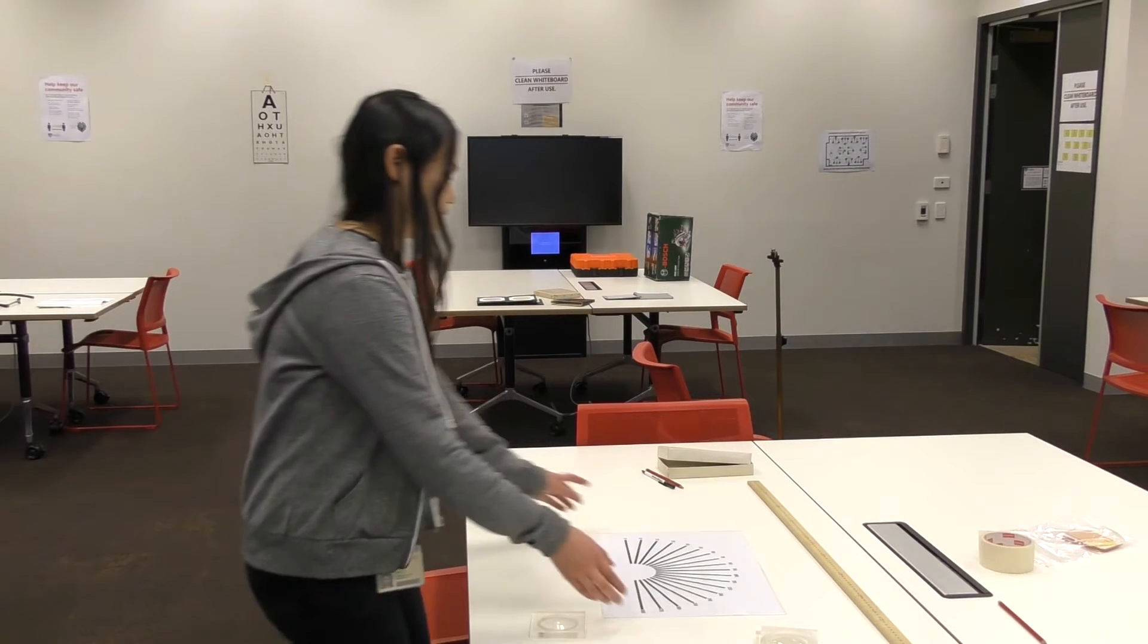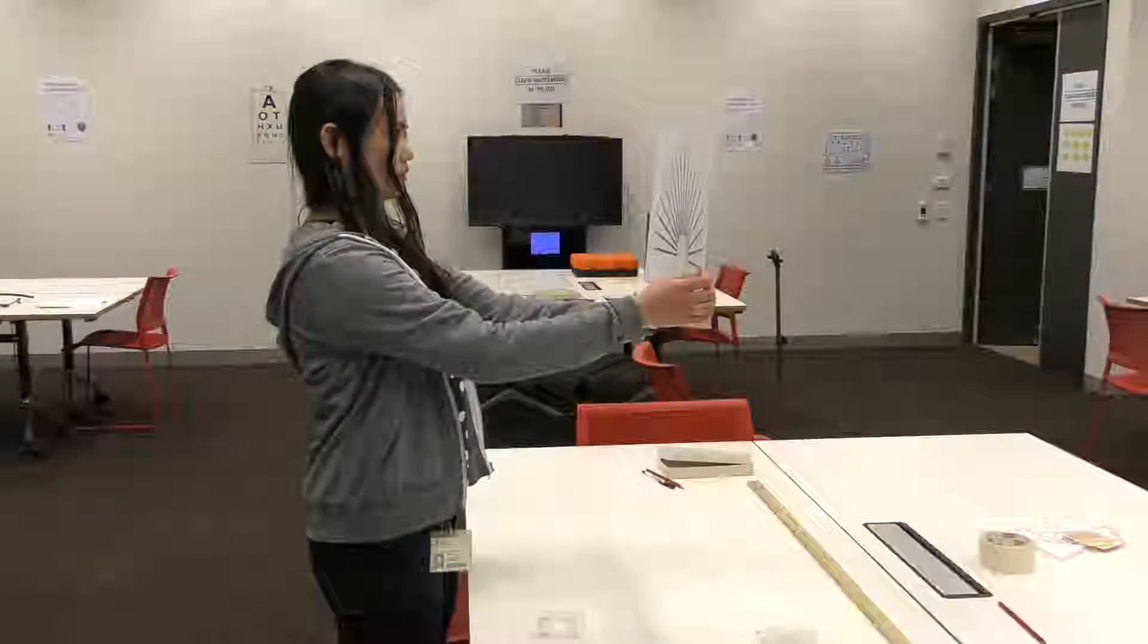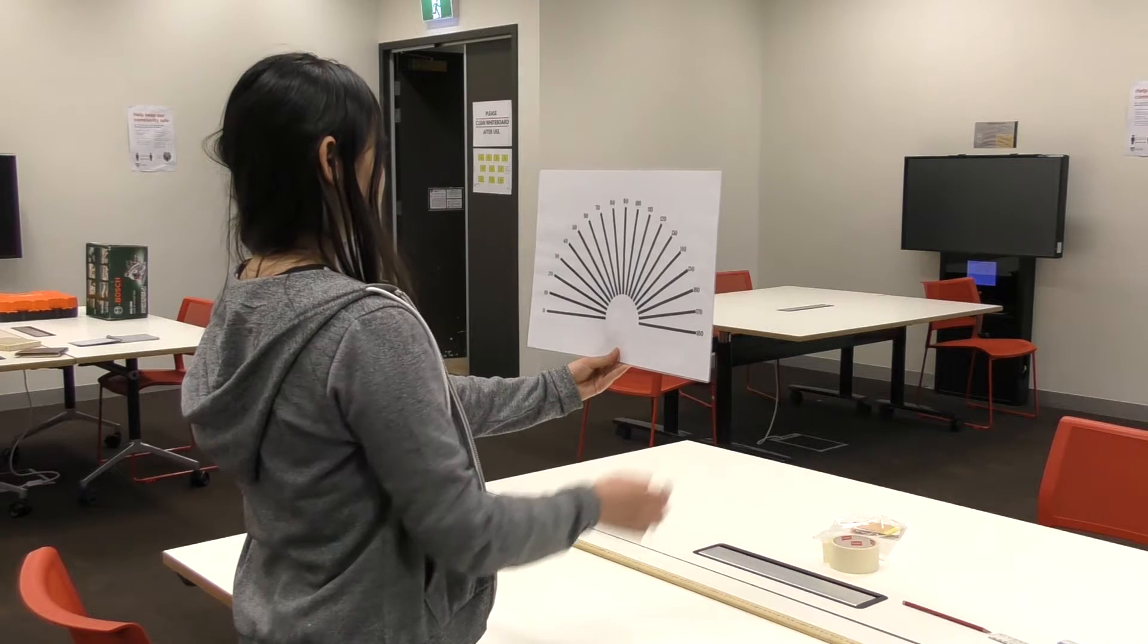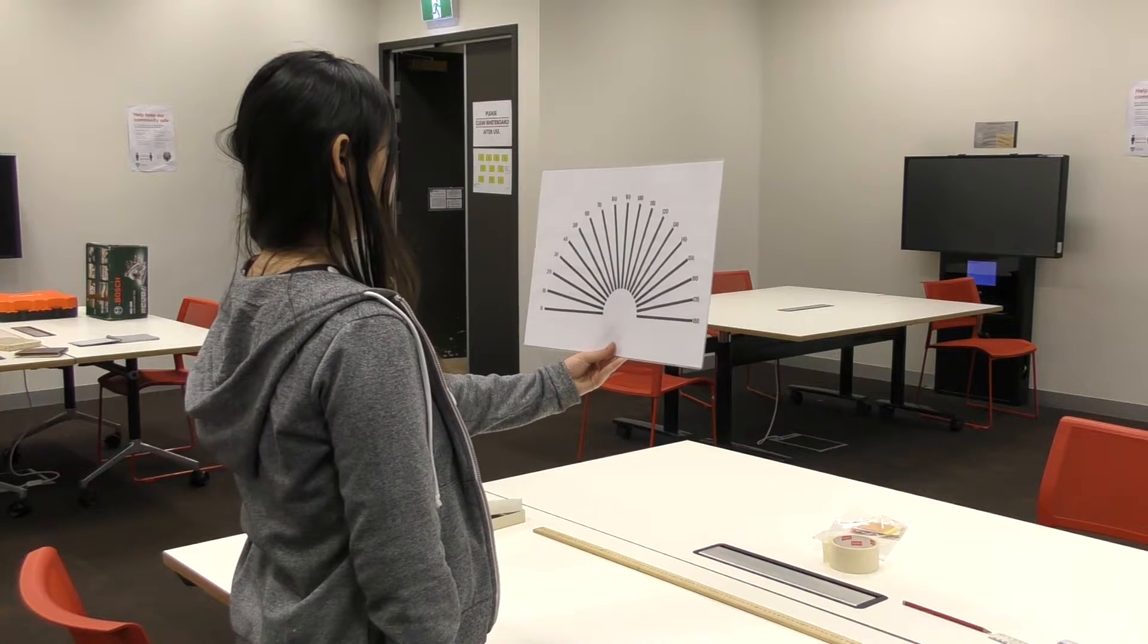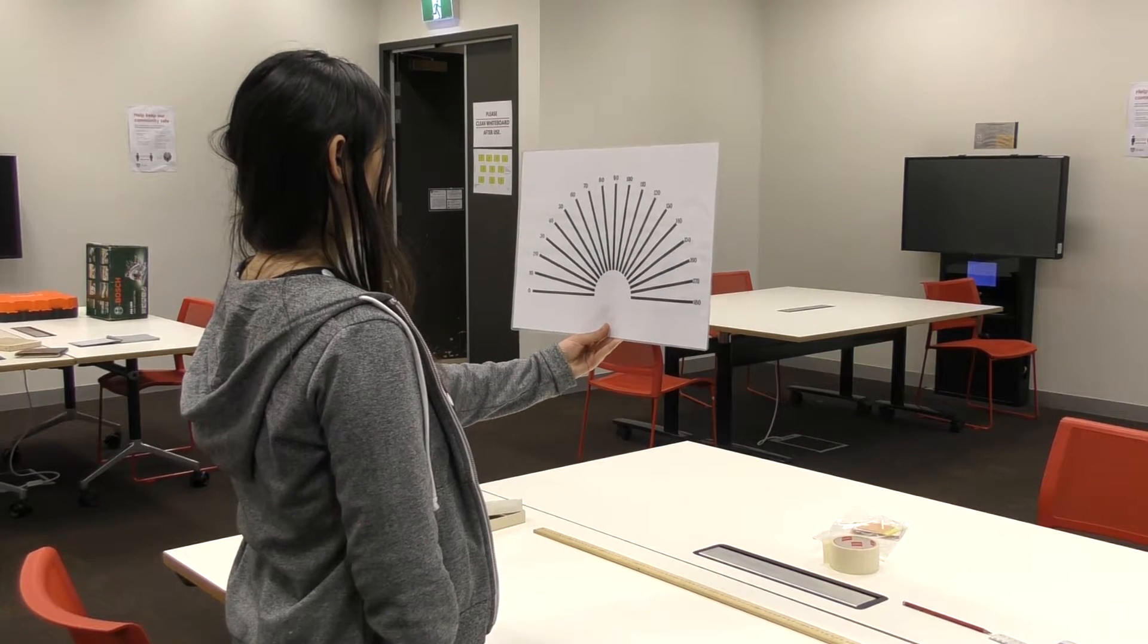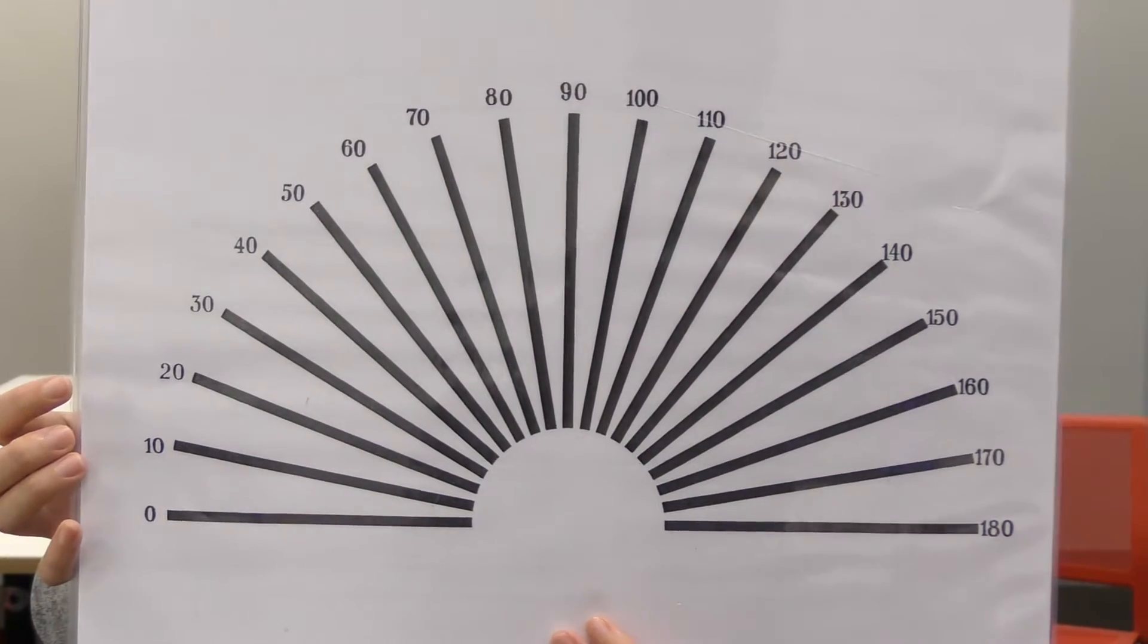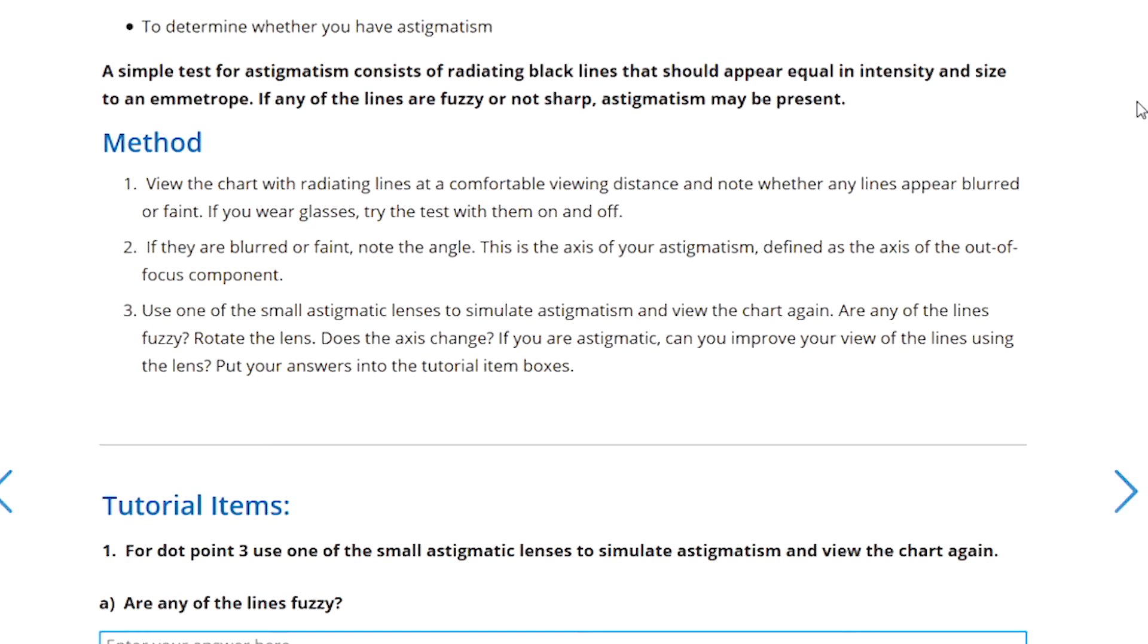Now we can examine for astigmatism by using a chart such as this which has a series of radiating lines at different angles and depending on your type of astigmatism different lines will appear in or out of focus. If any lines are blurry or faint then note the angle and this is the axis of your astigmatism as described in step 2 of the methods for this activity.